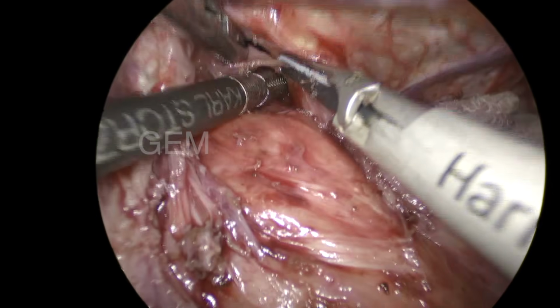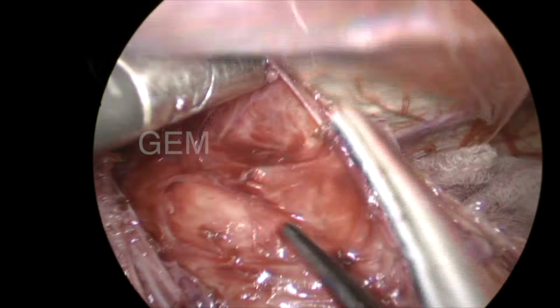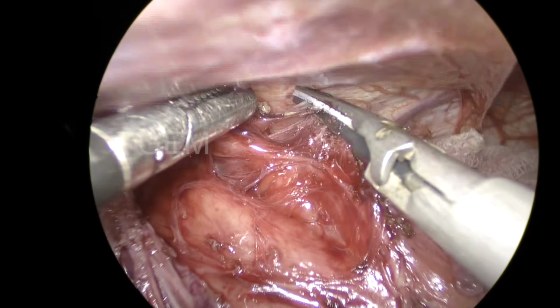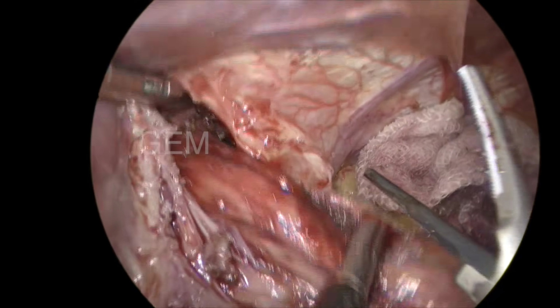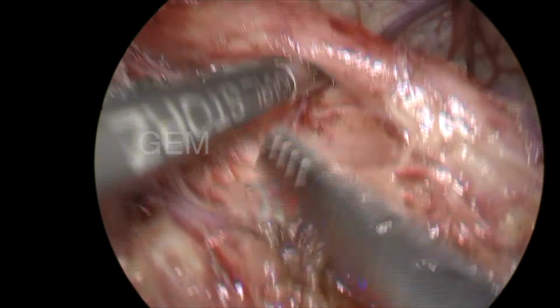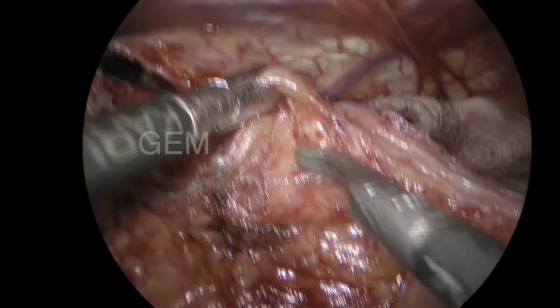So again, confirm and then divide. Any fascia we are dividing, confirm and then divide. That is considered very important. Even if you are confident, check once and then divide the tissue. So I want to see the posterior vagus now.